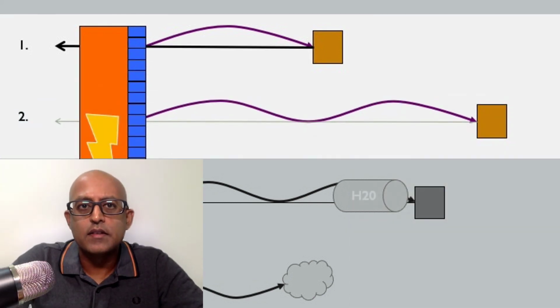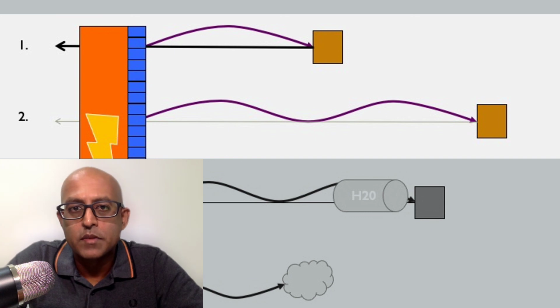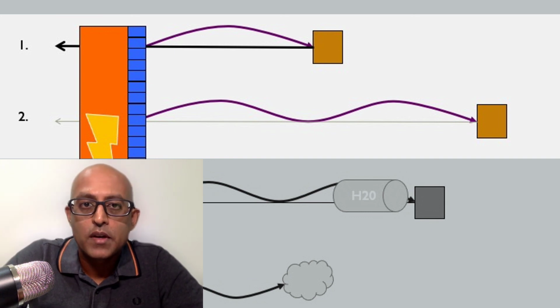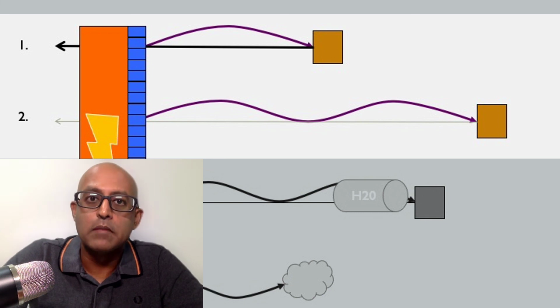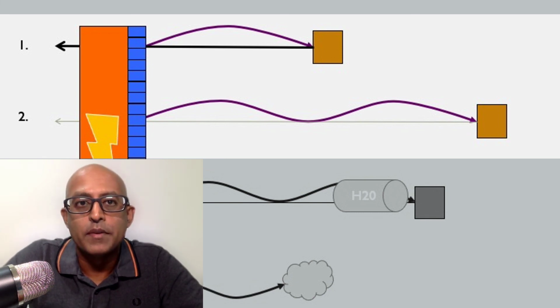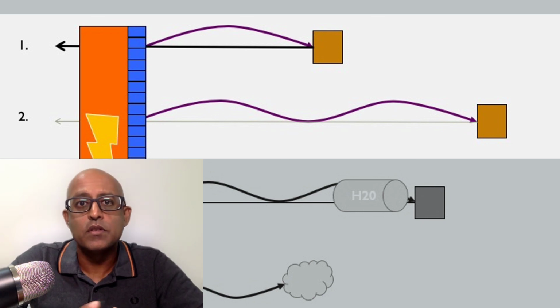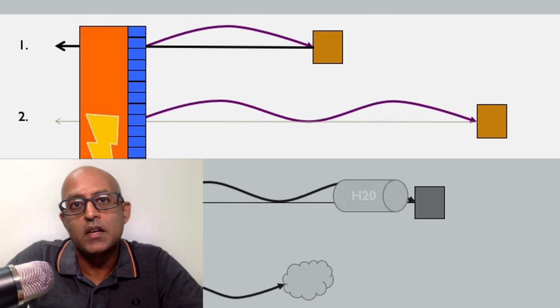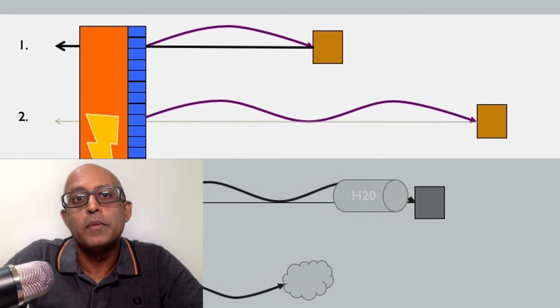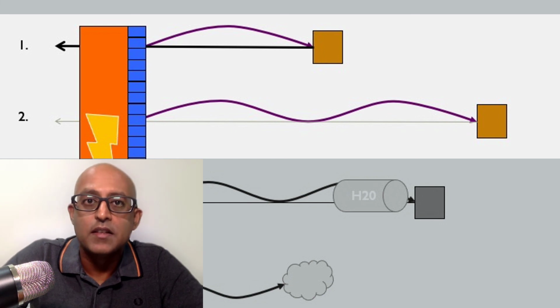Now let's say the same structure from the previous image is deeper within the tissue. The sound waves have to go further and have to come back a long distance as well. And as a consequence, what will happen is there's attenuation. So the surrounding tissue will absorb some of the sound wave energy. And as a consequence, while it appears deeper on our image, it will also appear darker because there's less signal coming back.